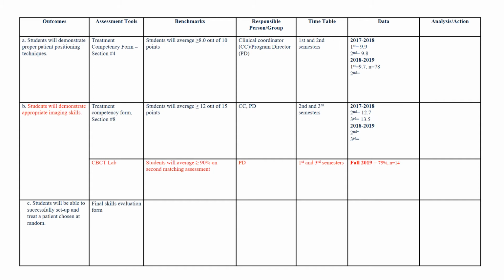In radiation therapy, over the past 10 years, image guidance has been a huge component of what we do. Basically, we perform a miniature CAT scan on the patient on the treatment machine, and we fuse that image with the images that were taken for the patient's treatment planning session. We can fine-tune the patient's positioning so that we can get the area of interest within millimeters of where we want it.